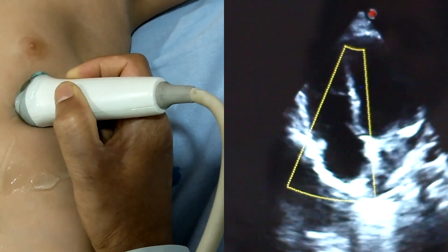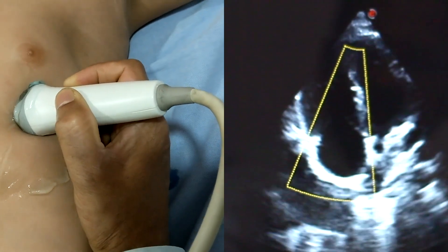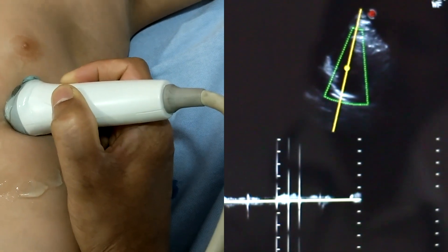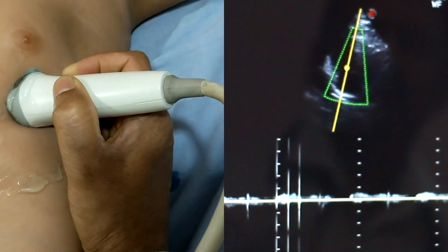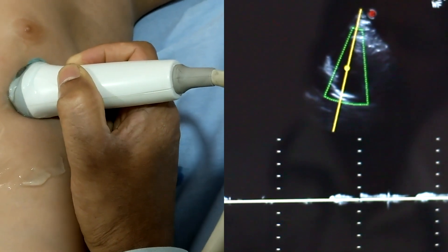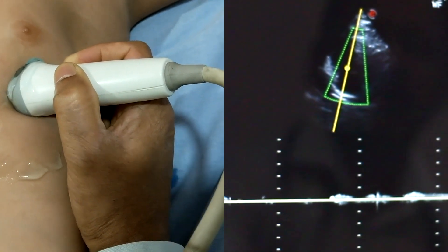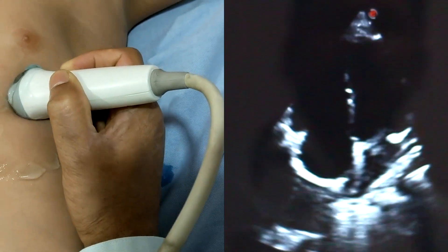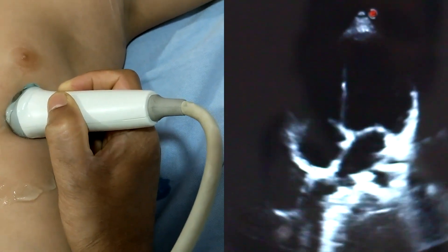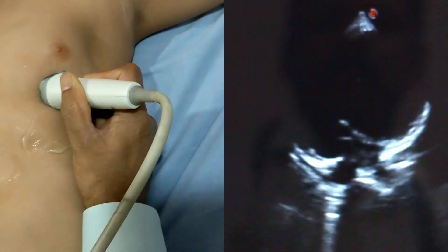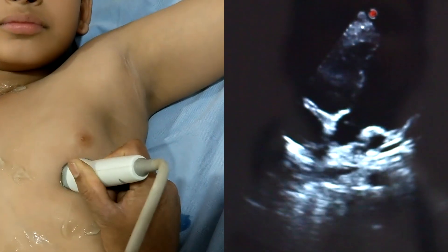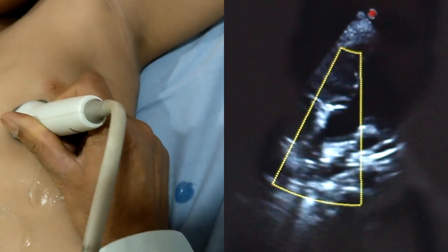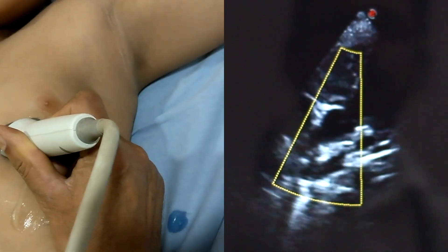Next is the tricuspid flow — color flow from the right atrium to the right ventricle. In this view, we can assess whether there is any tricuspid regurgitation or tricuspid stenosis. By the same approach, we can evaluate chamber enlargement, right ventricle enlargement, and right atrium enlargement.